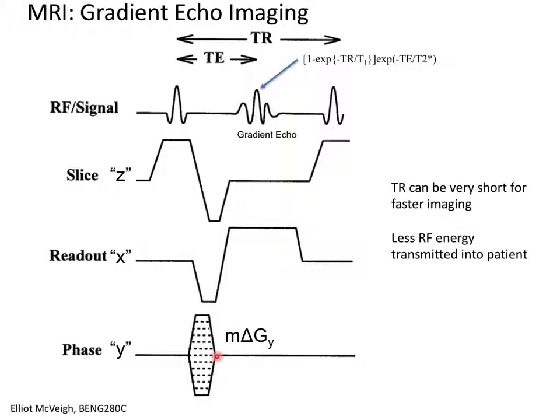I'm going to step through different sizes for different RF pulses to get a 2D raw data set. And that can occur during this refocusing here. This is all just magnetization management over here.